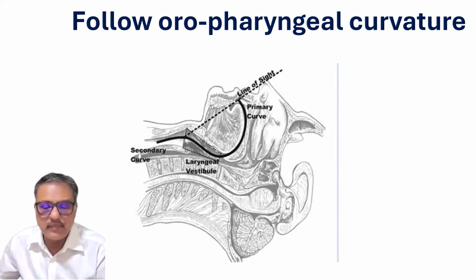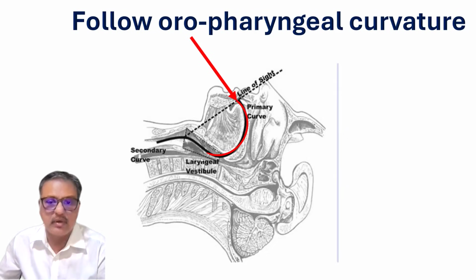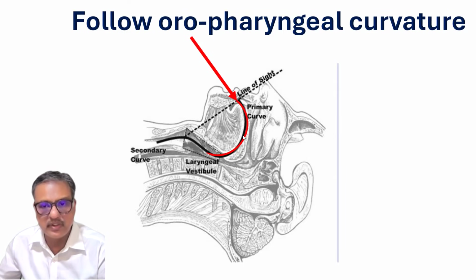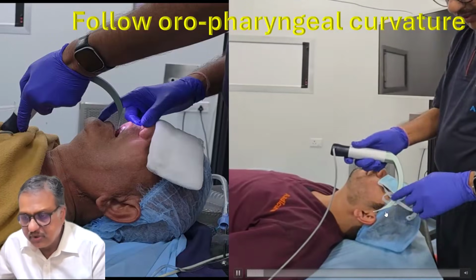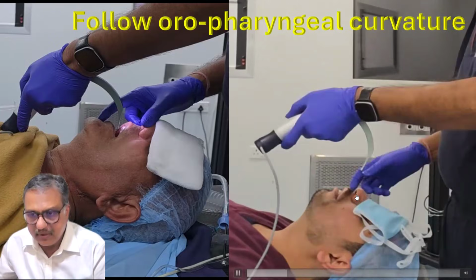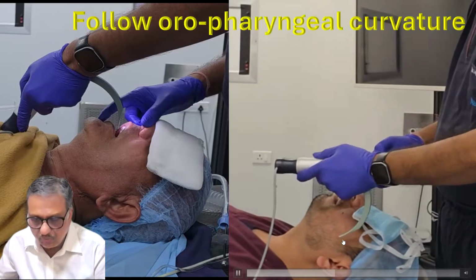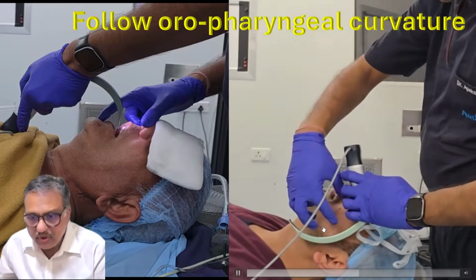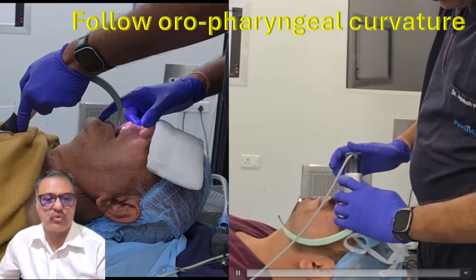And when you are inserting the videolaryngoscope D-blade parallel to the hard palate and soft palate, then you have to follow the oropharyngeal curve, follow the curve of the tongue, follow the primary curve. So you have to make a rotation in such a way that it follows the primary curve. Look at this. I'm using the D-blade. It has to be inserted in the midline, parallel to the hard palate and soft palate, and then you have to rotate as per the oropharyngeal curve. So the tongue is going to rest on this blade, which significantly decreases the force of laryngoscopy.